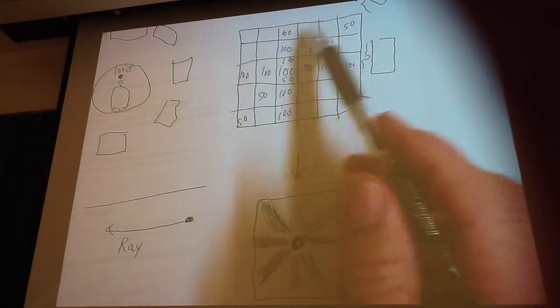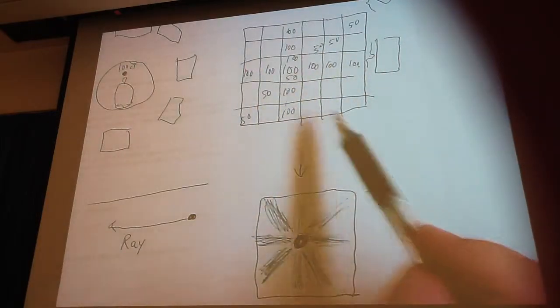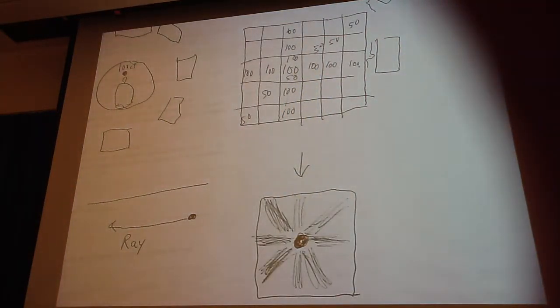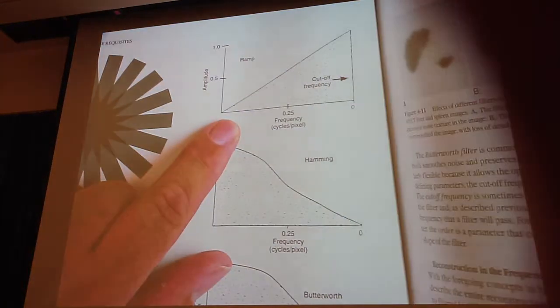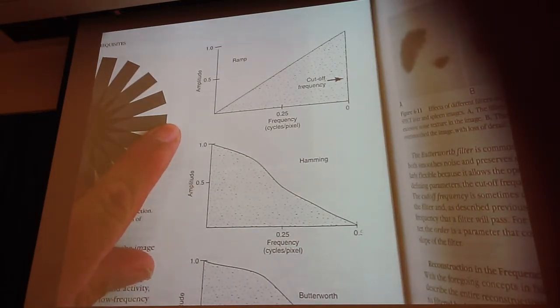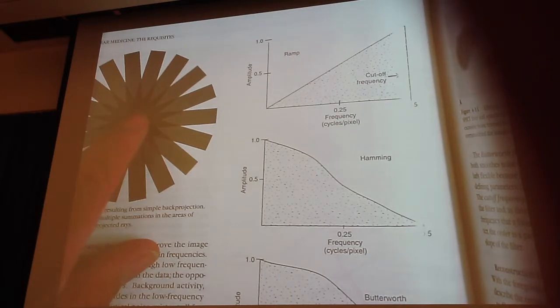If I get an average of what all of the numbers are going from all 64 different directions, and I subtract that number, we actually use a filter called a ramp filter. On page 58, this is what we use to eliminate that star artifact. It's a filter that on the edge of the image, there's not really that many counts, but this thing removes them, and it keeps on removing them at higher numbers until it gets to the object.